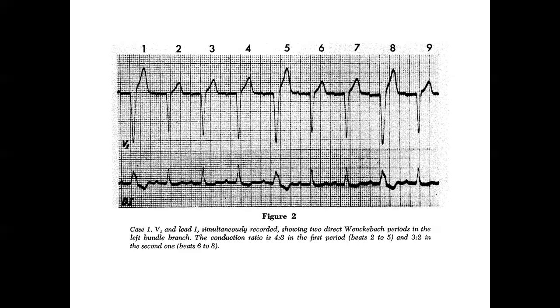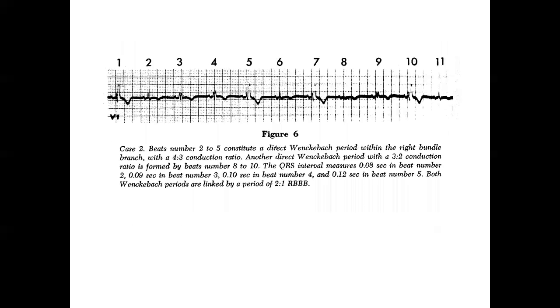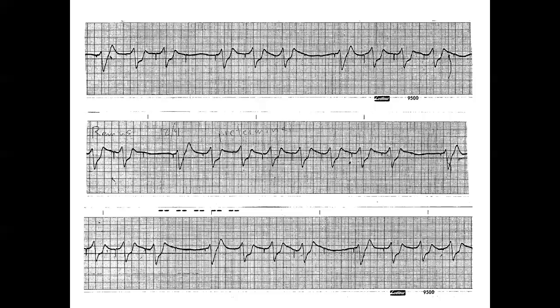Are you comfortable with this? Both that and this one. It makes sense. Normal, slightly right, more right bundle branch block, complete right bundle branch block. Okay, this patient is being paced, but pacemaker to QRS is short, longer, then eventually pacemaker fails to pace the ventricle.